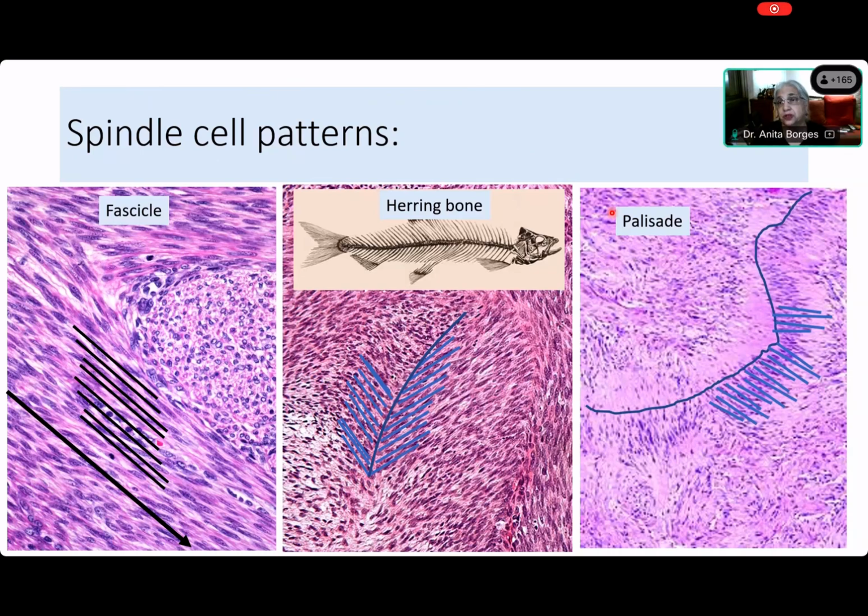Right. So what is the minimum thing that you require? I can't be running to the book every time to check whether it looks like a fence made up of elongated slats, cells parallel to one another. There are many kinds of fences, but a palisaded fence has cells that are elongated, with or without elongated nuclei. It doesn't matter what the nucleus is for a palisade. But if I'm talking about spindle cells that are forming a palisade, then yes, the nuclei have to be elongated, because that is what defines a spindle cell. Do you understand that now, Kedar? Does everybody understand it? If there is a problem anywhere, then please let me know. It's important. Okay. Very good.